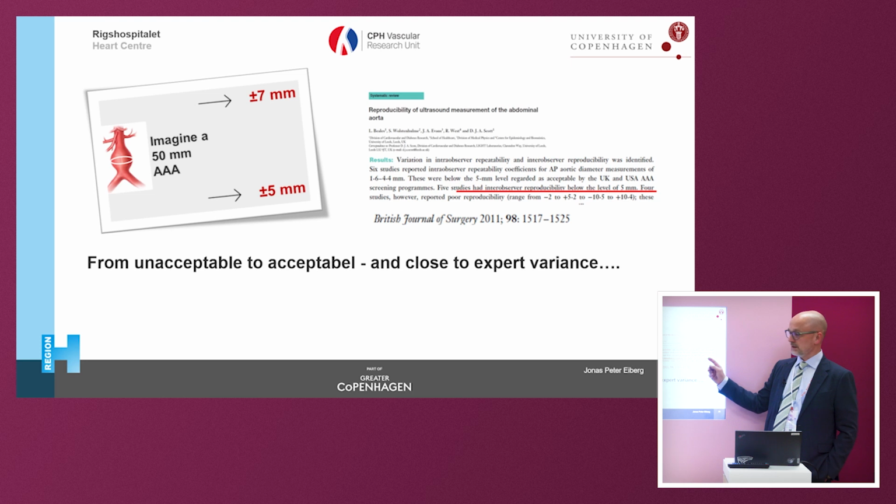And remember the figures we had in the beginning, that the best studies in the British Journal of Surgery had an inter-observer reproducibility of approximately 5 millimeter. So we turned these novices into experts according to this.